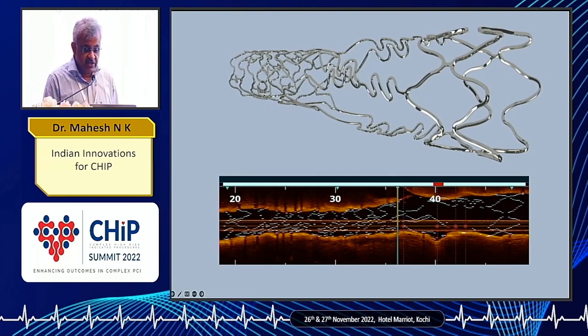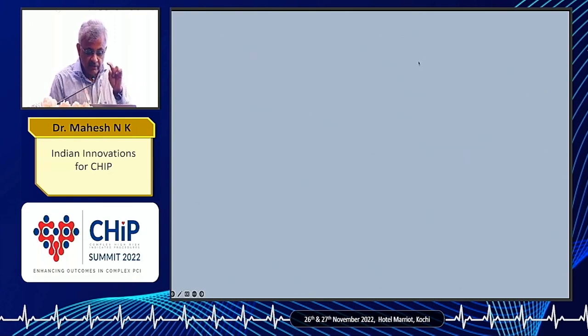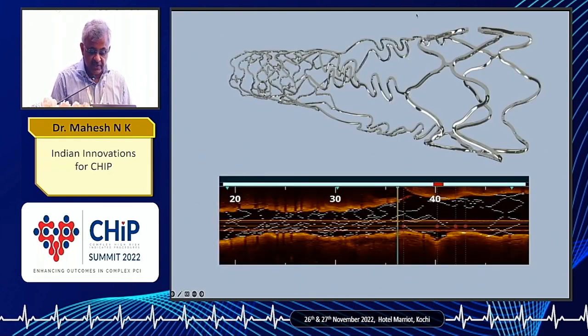You can see that the distal stent has been exactly copied here. There's a normal stent, open cell design. And then you have these long single wire-like projections, which is seen across the opening and into the main vessel, and you have a closed cell design to anchor the whole thing.